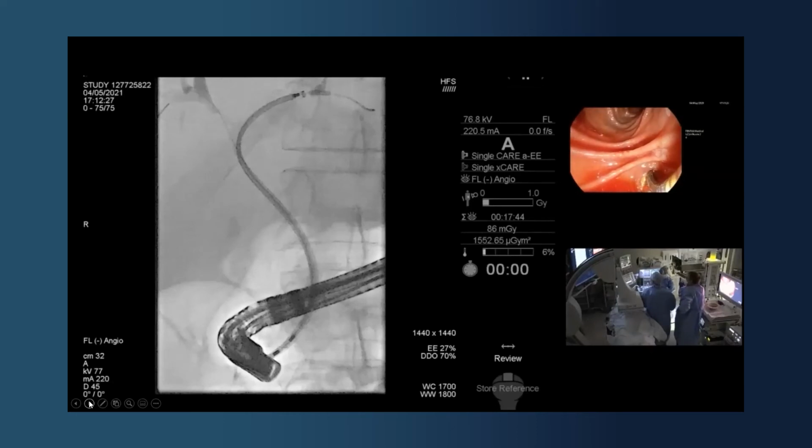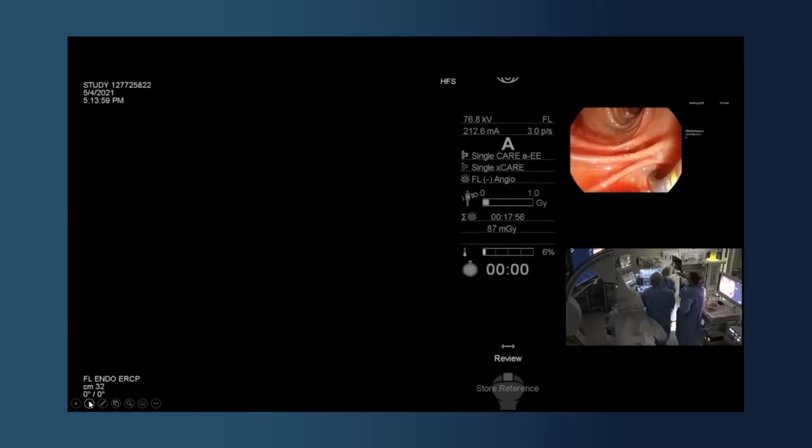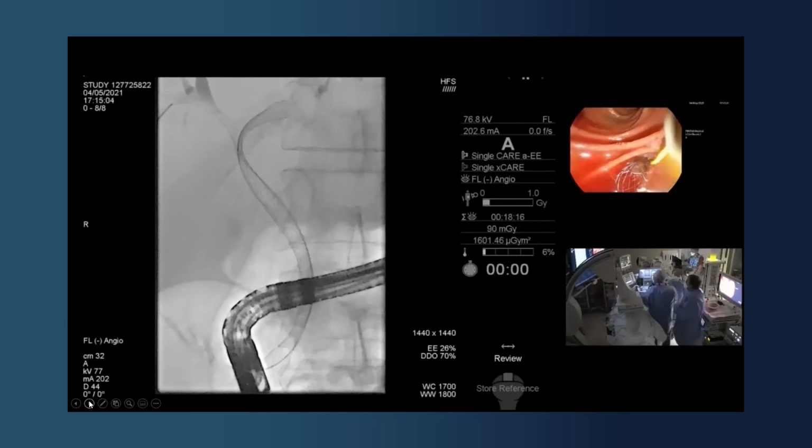Screen please. Now you're in a perfect position at the top end. Let's see if we've got enough at the bottom end. So, yeah, lovely deployment at the top end. Beautiful. Okay, good. Okay, so excellent.